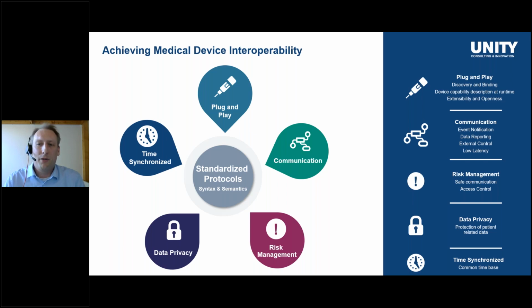Moreover, if you don't want to set it up all manually, we would need some kind of plug and play capability, but of course you have to say plug and play in quotes. It basically means that we need some mechanism to discover the devices inside our setup and to get to know which capabilities they have. Different ventilators may have different capabilities, same as for patient monitors or infusion pumps. And the system should be designed in a way that if we add a new device, let's say a dialysis machine, we may also want to display that data and even have the possibility to control some of the settings.